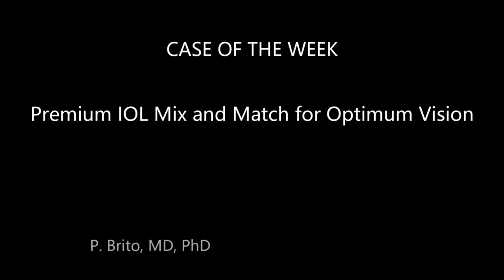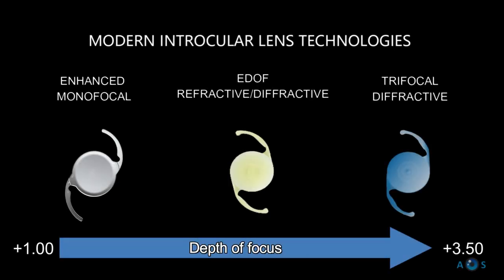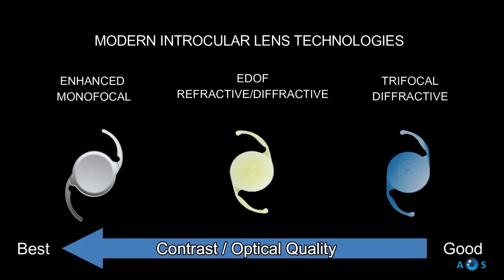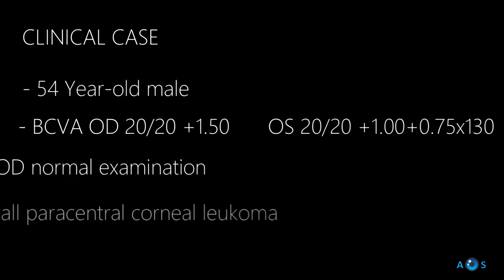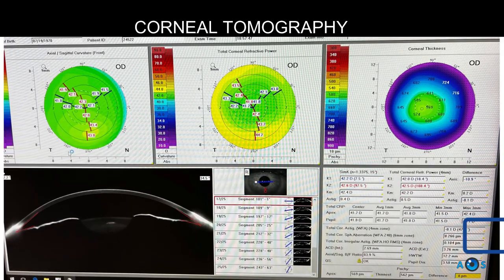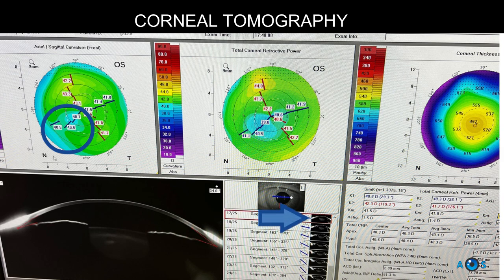The last 10 years have seen the launch of many intraocular lens designs that promise to extend the range of uncorrected vision. Therefore, it is important to know the major pros and cons of the different IOL technologies. Most patients expect to achieve glasses-free vision, but not all are candidates for diffractive IOLs. However, with a mix and match strategy, almost any patient can achieve a functional range of uncorrected vision.